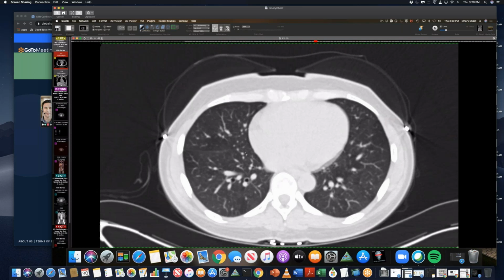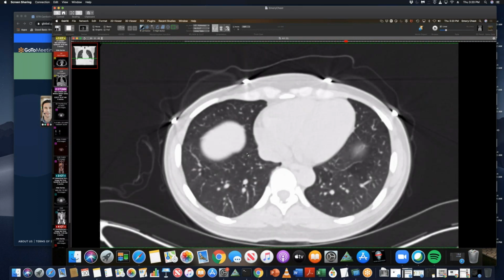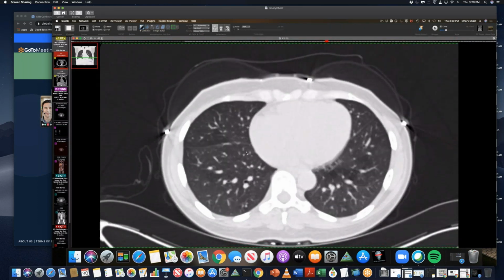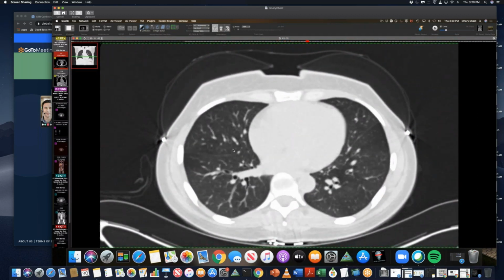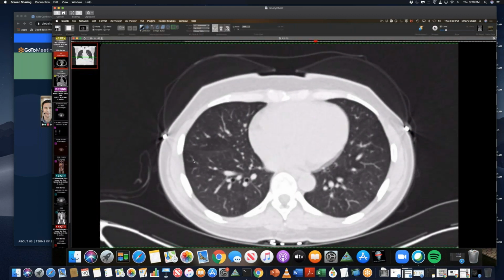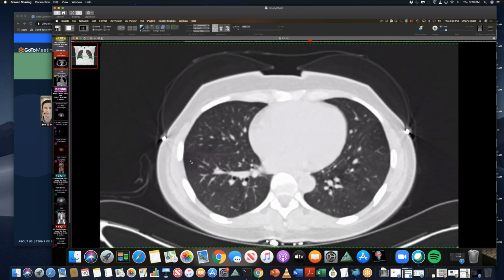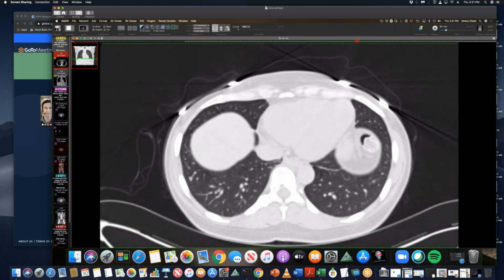I don't know. I've seen it cause air trapping, but I don't know. I wonder if it's some kind of similar process pathophysiologically, like the bronchiolitis obliterans type of thing. Okay. The other thing I thought about is, could this be an alternative, DIPNECH at the same time? Although that would be a little coincidental. How old is the patient? I don't remember how old the patient is. I think she was middle age to older. Right demographic.